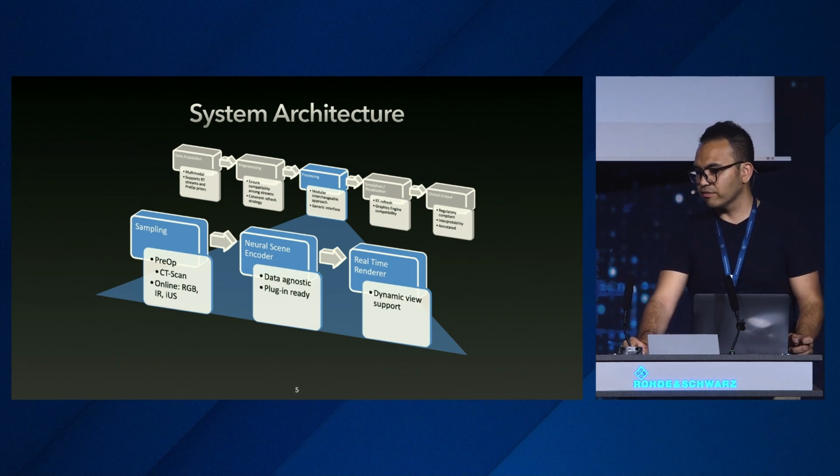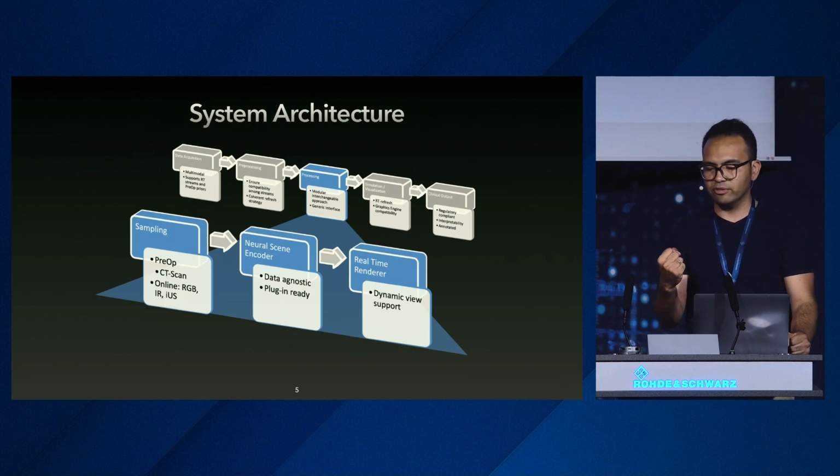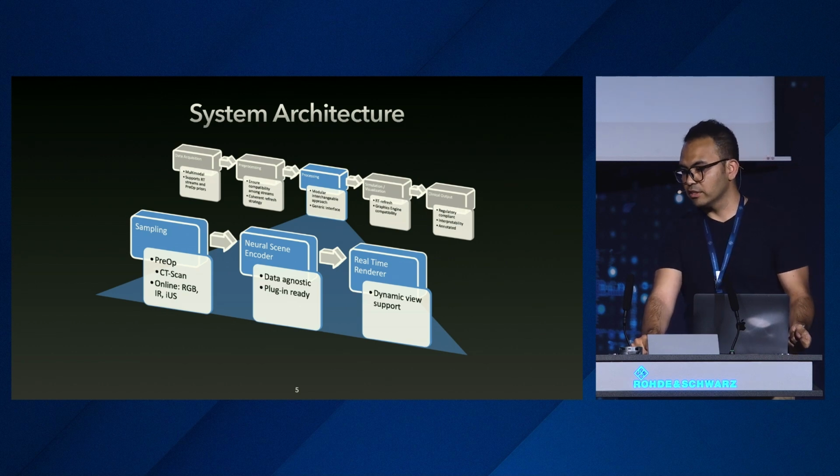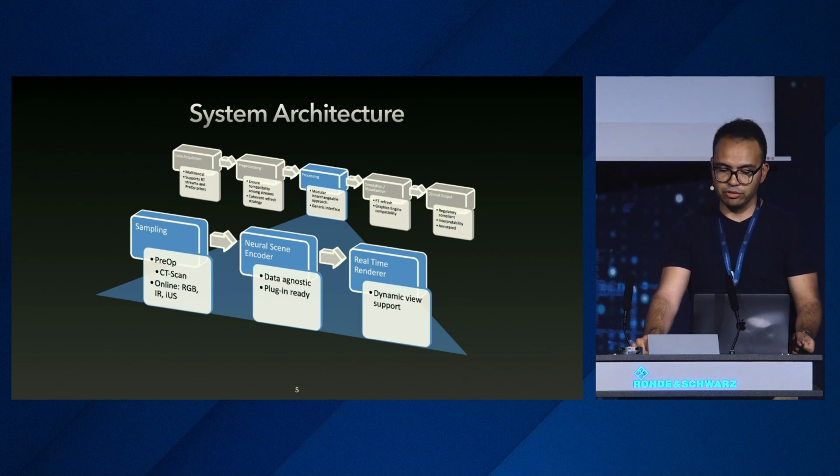After that, we have simulation and visualization, which takes these views from the processing module. In the end, we have the clinical output, which is the filtered version, taking into consideration regulatory compliance issues, and what the doctor should be able to see or not.